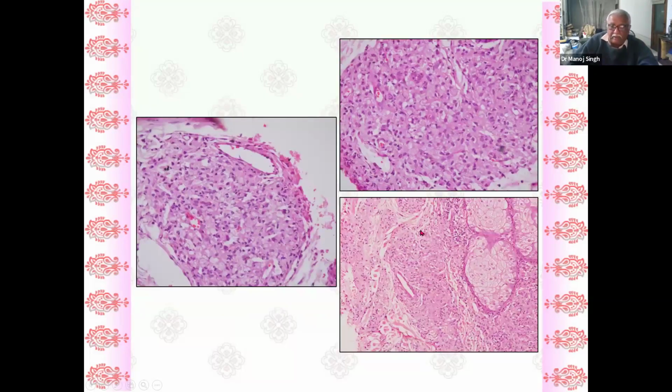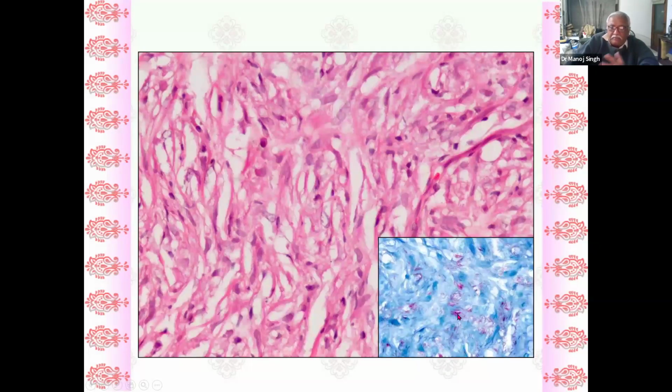And again, the follicles, the appendages, and sweat ducts are surrounded by this inflammation. And please note the foam cells also. And on the acid-fast staining, you have variable amounts of acid-fast bacilli present inside the foam cells, as well as scattered amongst the inflammatory infiltrate.